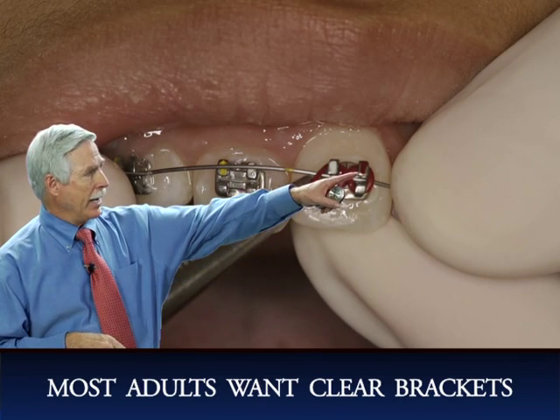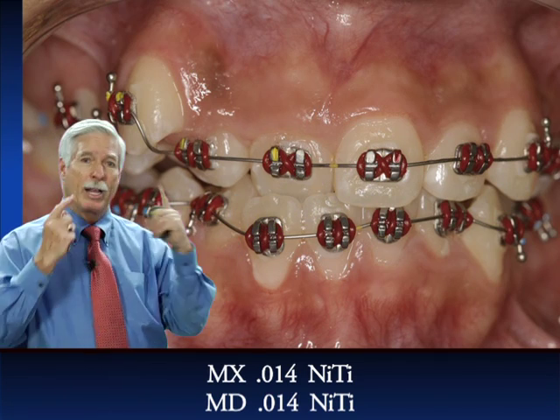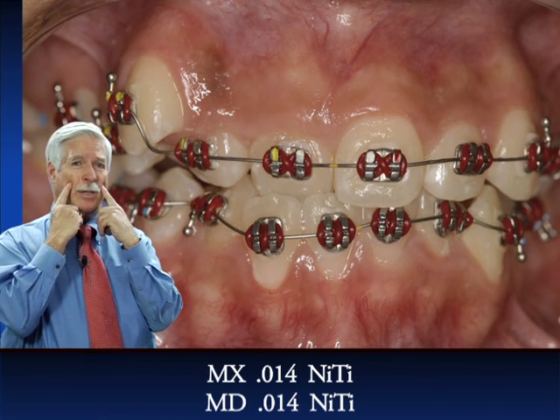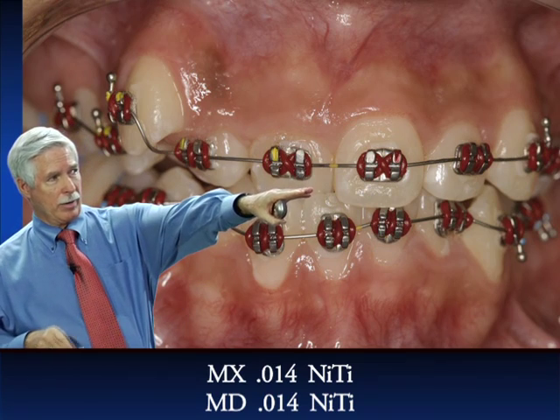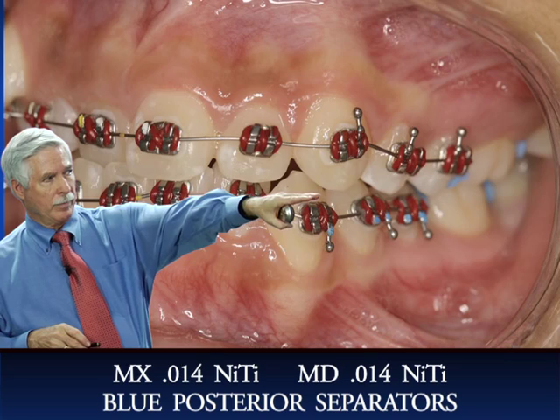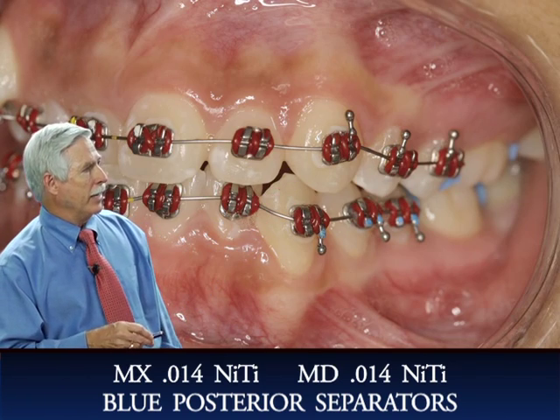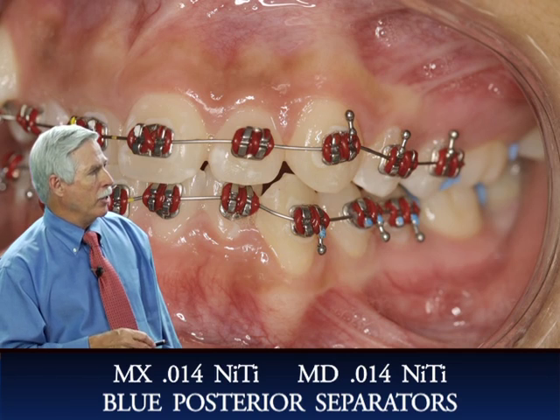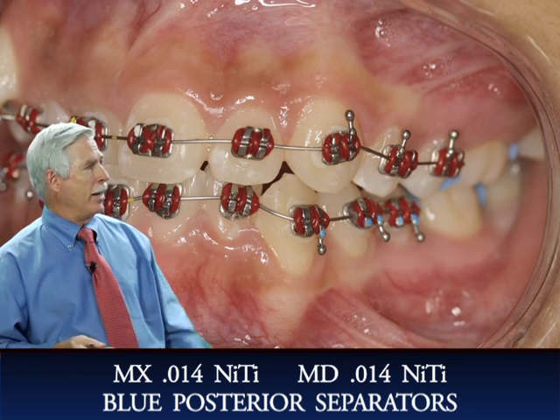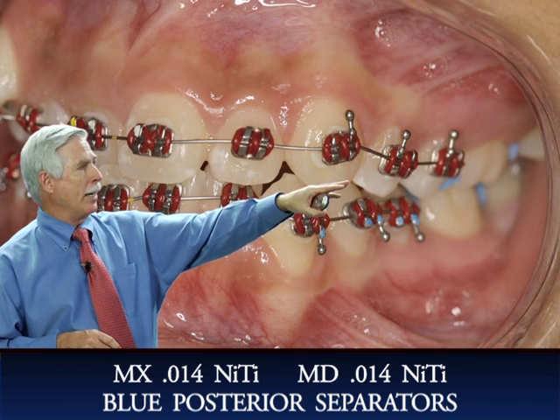So let's see, here's the case. So you can see we've put the wires in. I usually bracket from 2nd bicuspid to 2nd bicuspid, as you can see over here. Okay, so here the brackets are all on. And you can see you put the bracket on the best way you can on the tooth that's lingually displaced, and later you'll re-bracket that tooth.